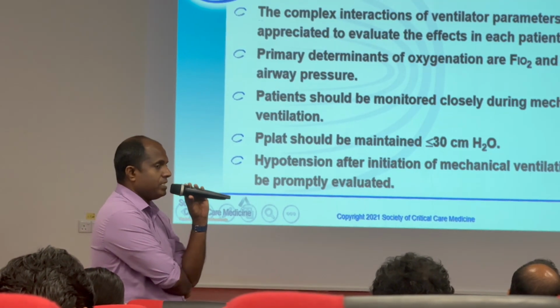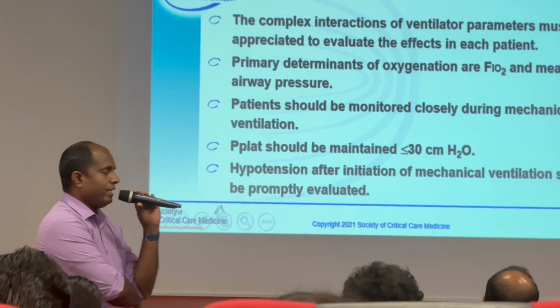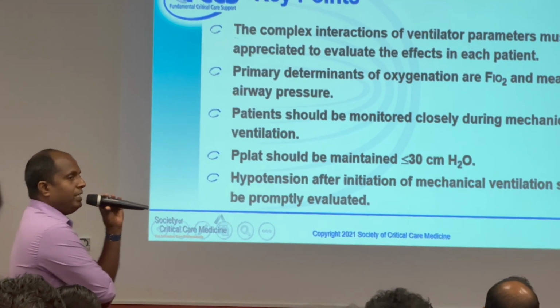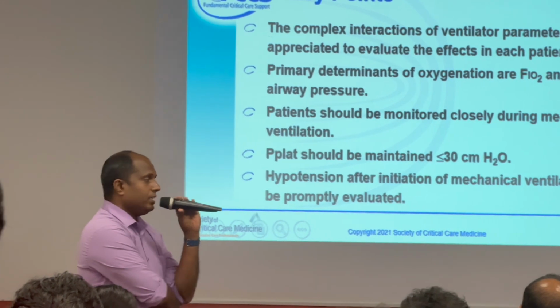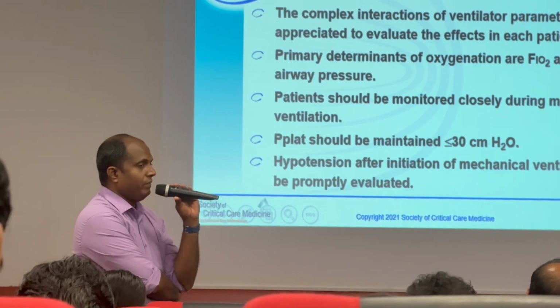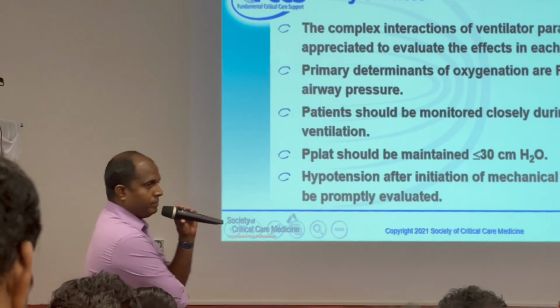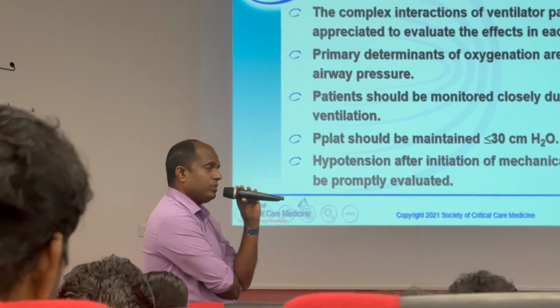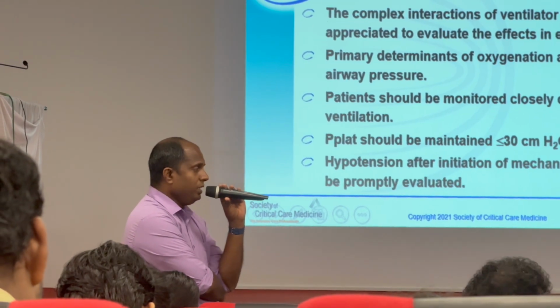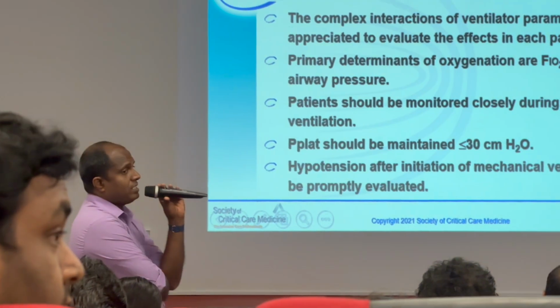Second one, asthma ventilation. Asthma physiology is that air can go in and not come out of the lung. So invariably air gets stuck in the alveoli, leading to dynamic hyperinflation and auto-PEEP. We need to prevent that by ventilating the patient carefully. Again, low tidal volume, FiO2 based on the saturation target, and minimal PEEP, even zero.